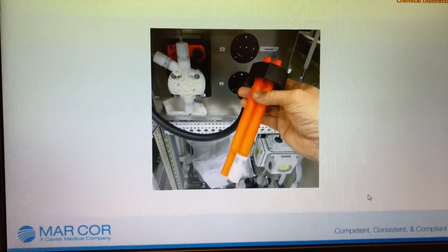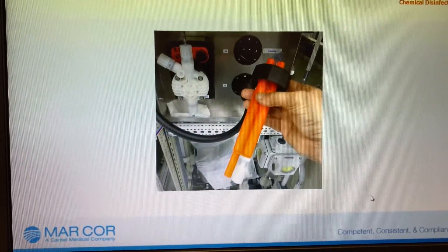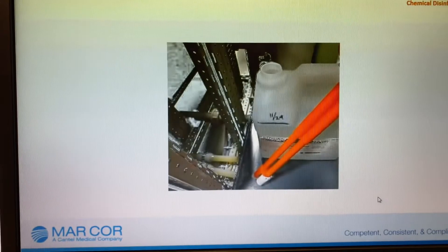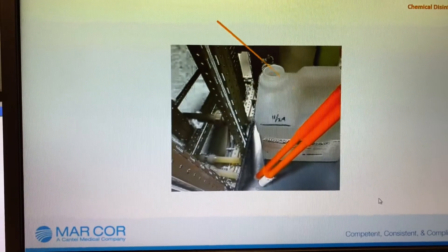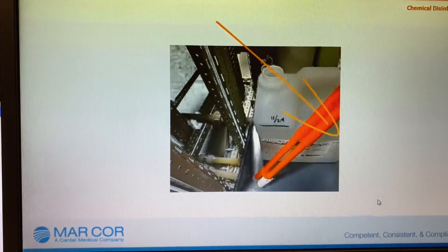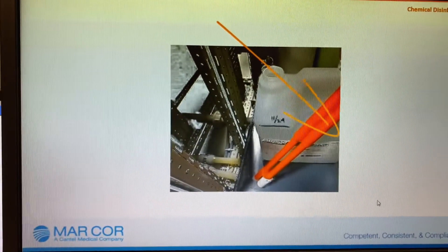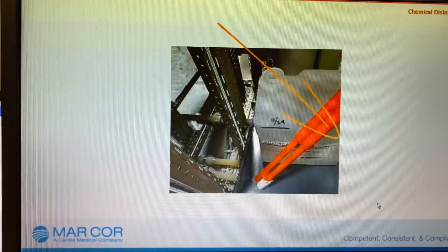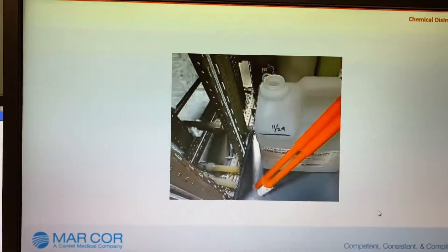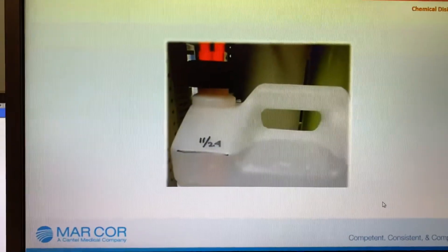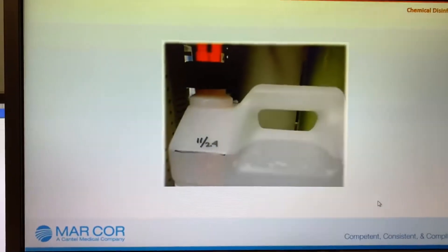The chemical wand is telescoping in length. Insert the wand at a 45 degree angle into the disinfectant container. Slide the cap shield into the jug to prevent backsplash.